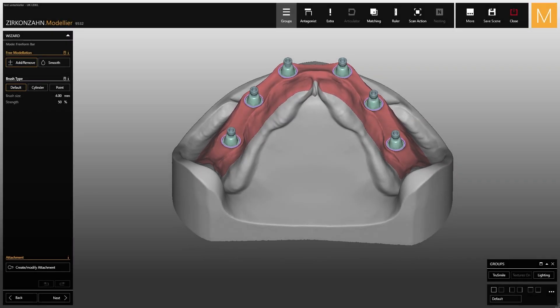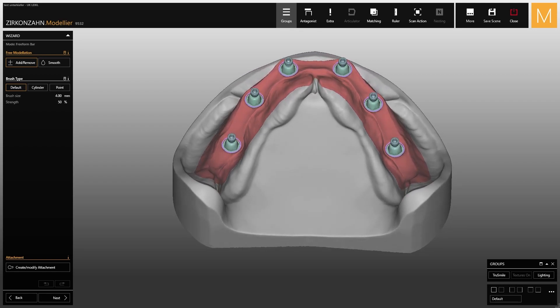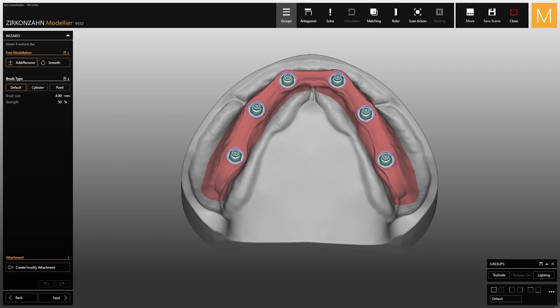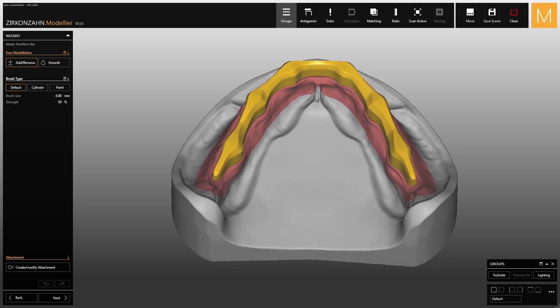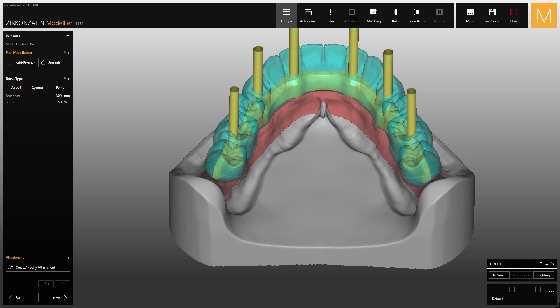This video explains how to use the double screw metal technique for designing your own restorations. The double screw metal technique is an innovative method of screwing the secondary structure to the bar. Thanks to this new technique, it is possible to avoid aesthetic problems caused by the screw thread created to fix the bar.